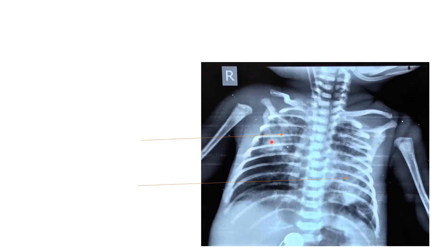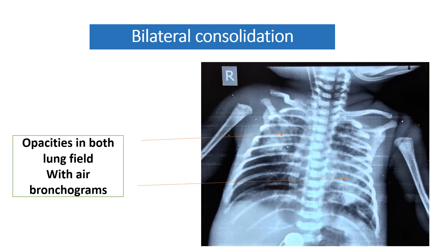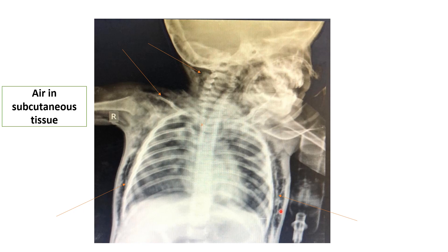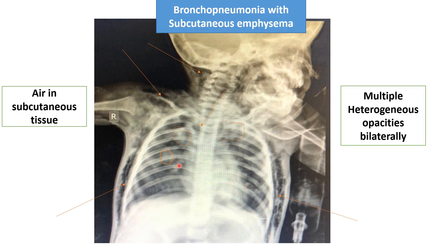In this x-ray, multiple opacities with air bronchogram are present in both lung fields — diagnosis: bilateral consolidation. Additionally, in the subcutaneous tissue of the chest wall and neck area, air is present — subcutaneous emphysema. This patient was having bronchopneumonia with subcutaneous emphysema; multiple heterogeneous opacities are present in both lung fields.